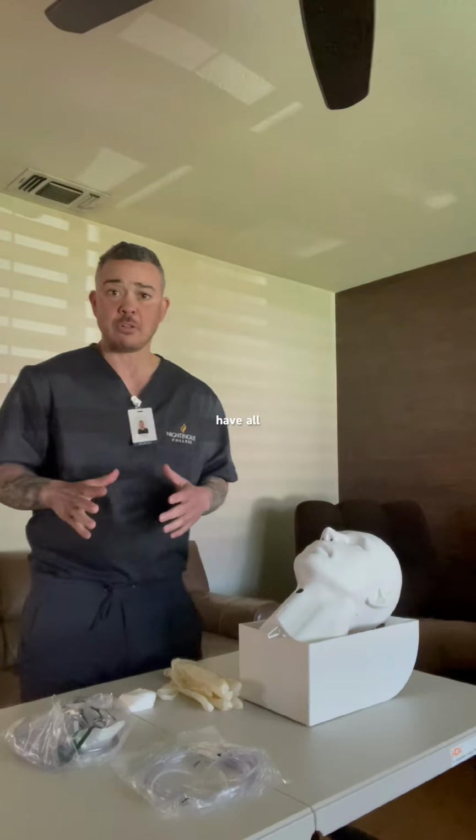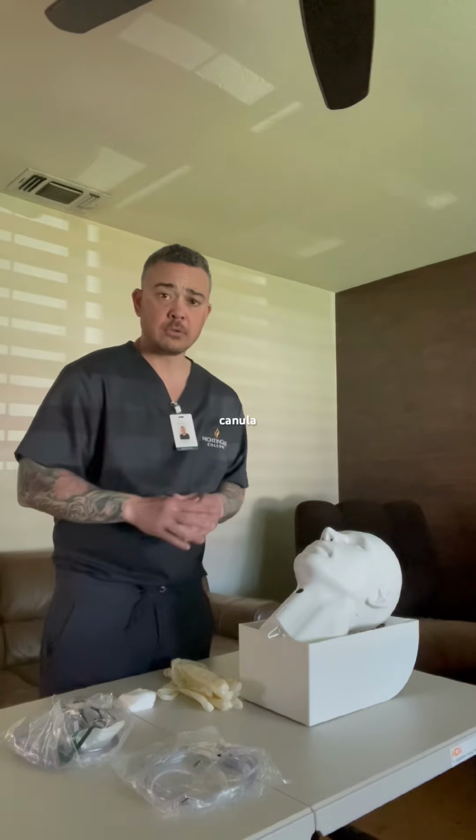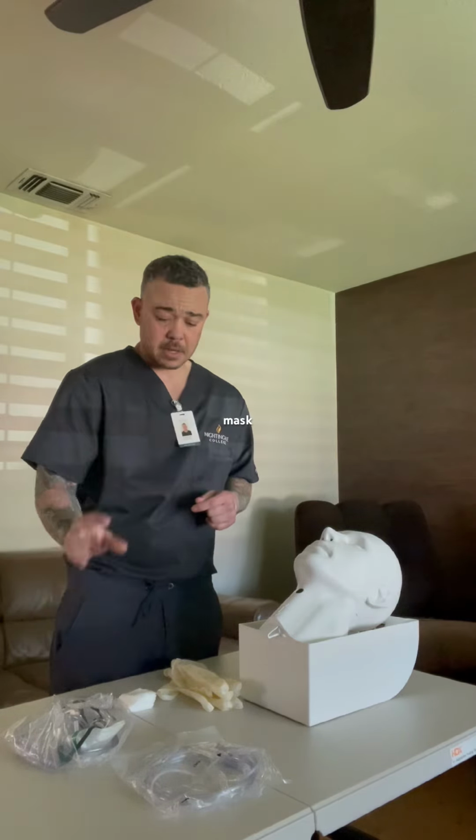I want to make sure I have all of my supplies needed for this skill video, and I have the nasal cannula, I have the non-rebreather mask, gauze, and gloves.